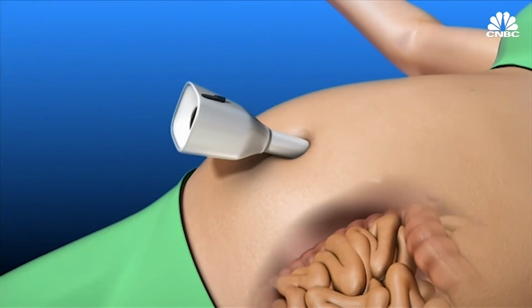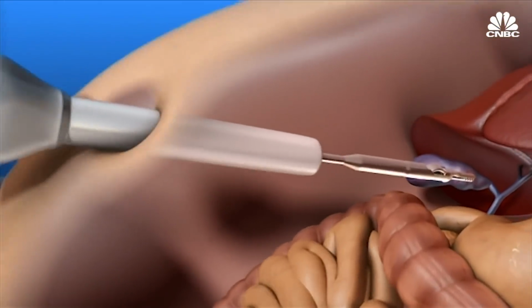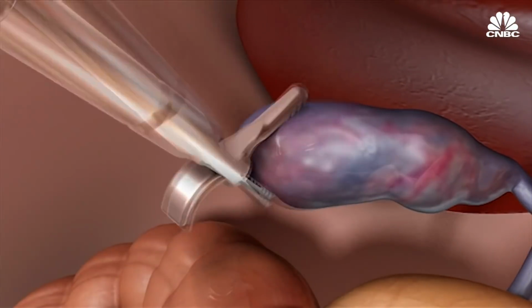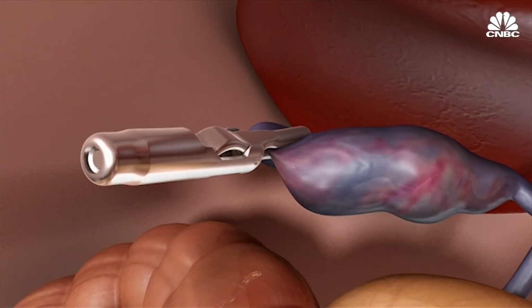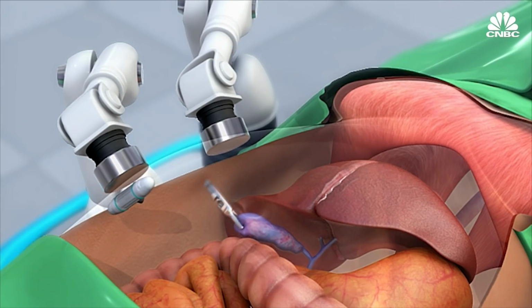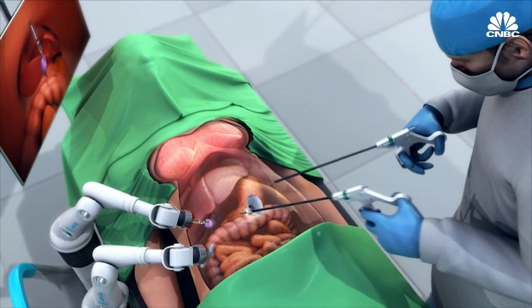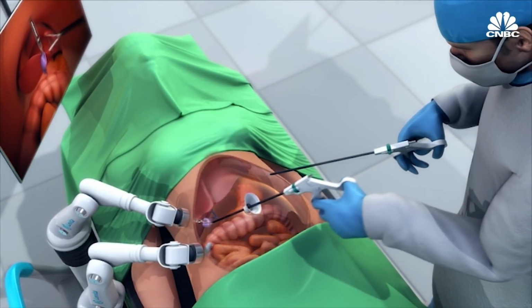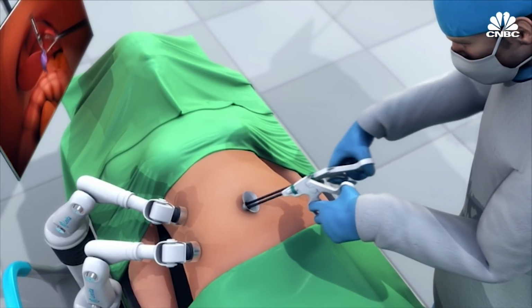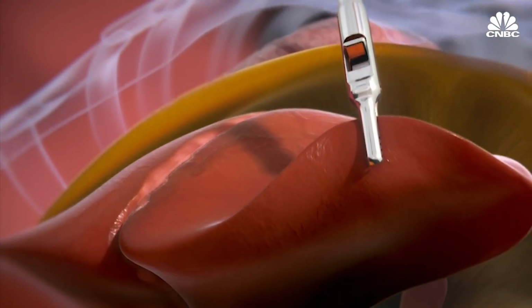The surgeon puts a magnetic grasper with a small magnet attached through the patient's belly button. He releases the small magnet onto an organ, one that needs to be moved around for the procedure. Then, the surgeon controls a magnetic arm on the outside of the body. It guides the magnet on the organ, getting that organ out of the way so the surgeon can get to the area he needs to work on. This means no extra incisions in the abdominal wall, where tools would normally be entered to move the organs around.